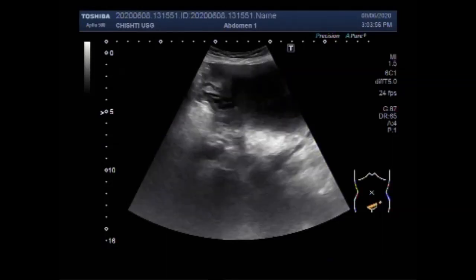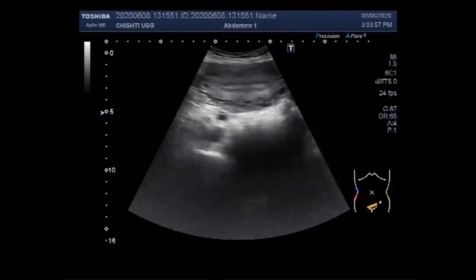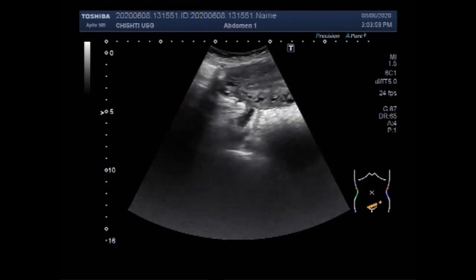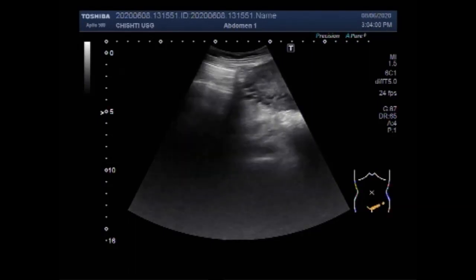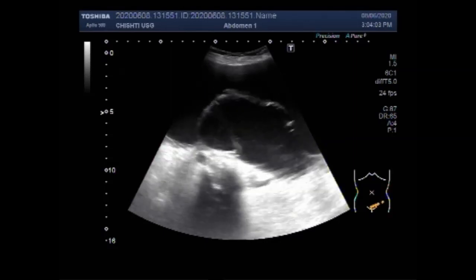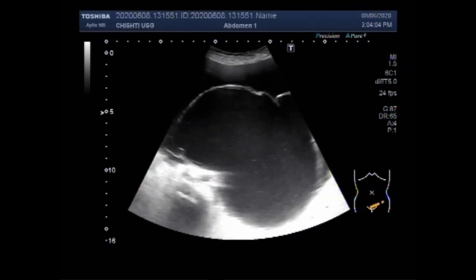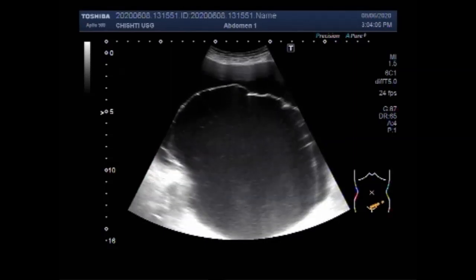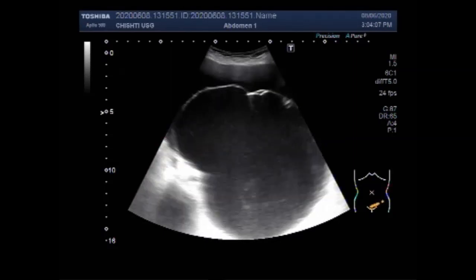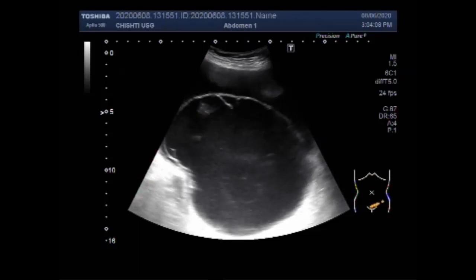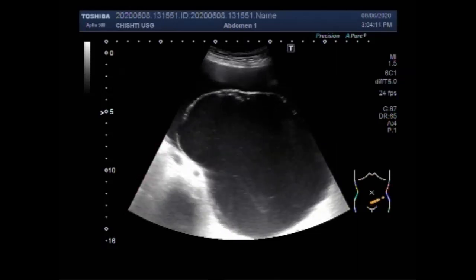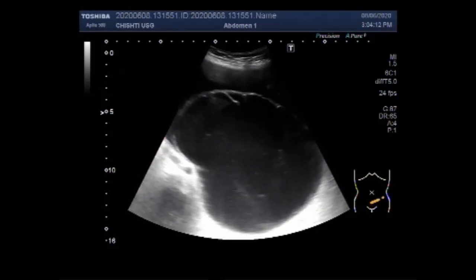Now you can see the uterus and it looks echotexture normal. This is a large multiseptated ovarian cyst, and a large amount of echogenic material is seen within it.